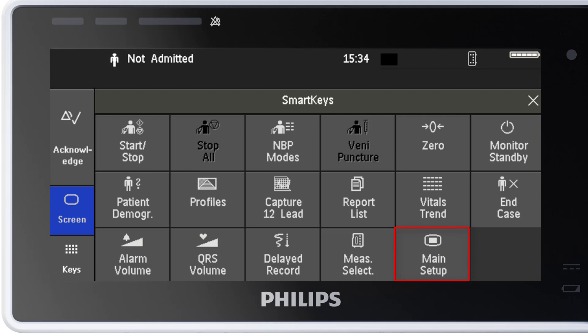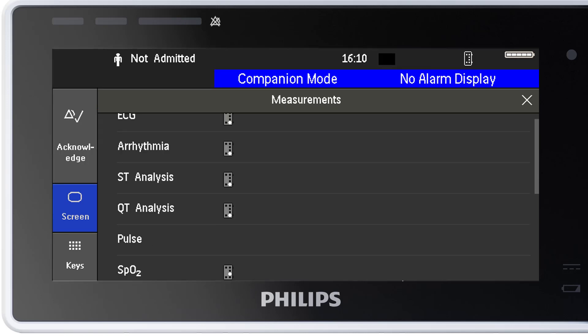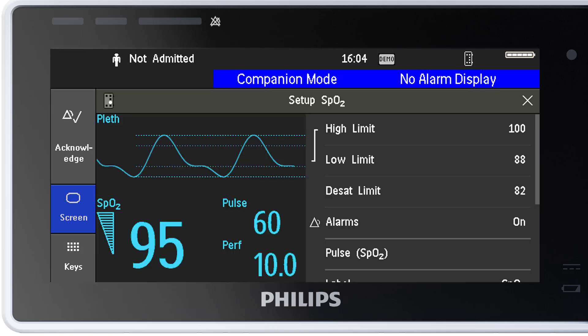The main setup key gives you access to all menus and functions in the monitor. The functions you need most are ordered at the top of the list. Take for example measurements — you probably need this one a lot. Under measurements, you will find all the clinical measurements. For example, here is the SpO2 — isn't that the exact same menu shown before?